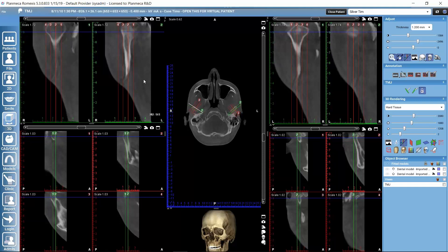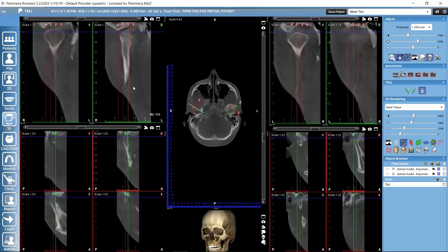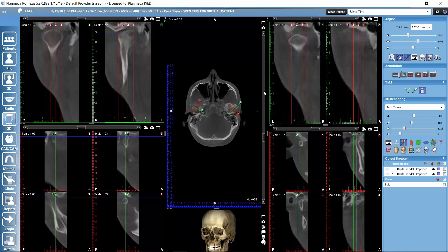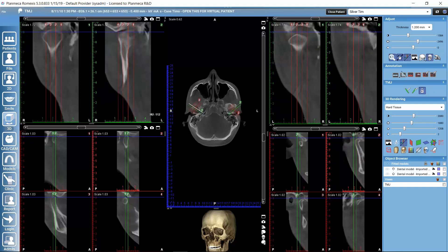Naturally, we can also move here the volume just normally. If we have activated this move rotate volume, for example, we can just simply grab the volume on these different views. We can rotate with the right mouse button. Left for moving and right for rotating.